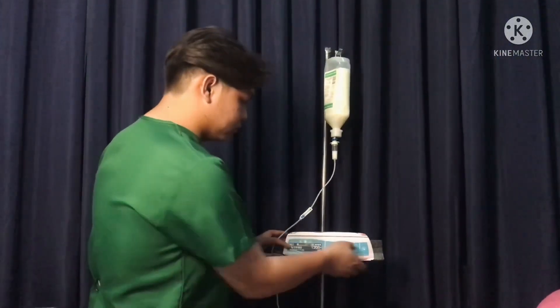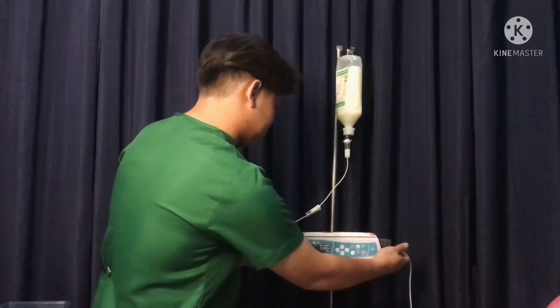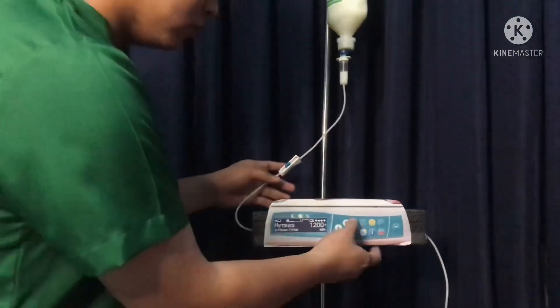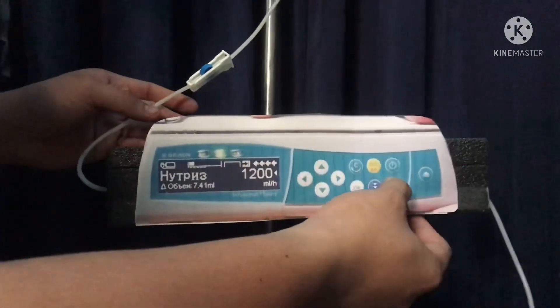Open the pump and insert the infusion set. Close the pump and open the roller clamp. Set the rate and volume to be infused, and finally press start.